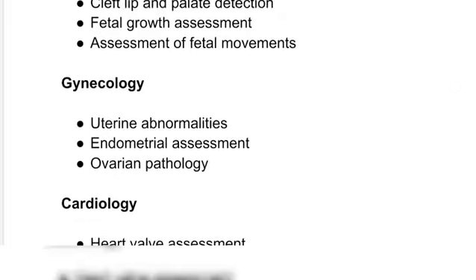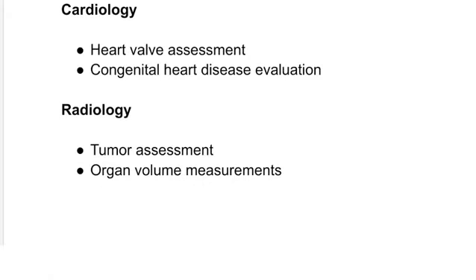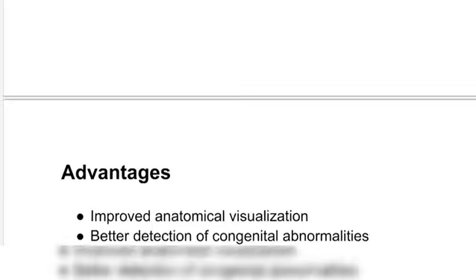In gynecology, we use it for uterine abnormalities, endometrial assessment, and ovarian pathology. In cardiology, we use it for heart valve assessment, congenital heart disease evaluation, etc. In radiology, we use it for tumor detection and organ volume measurements.